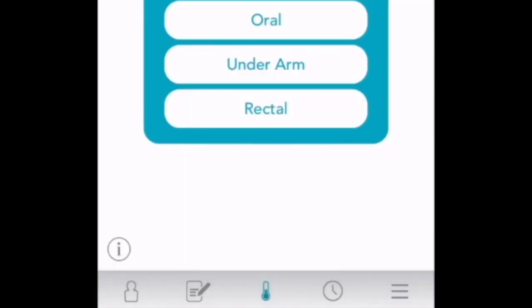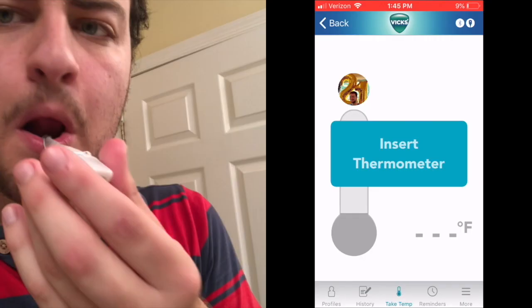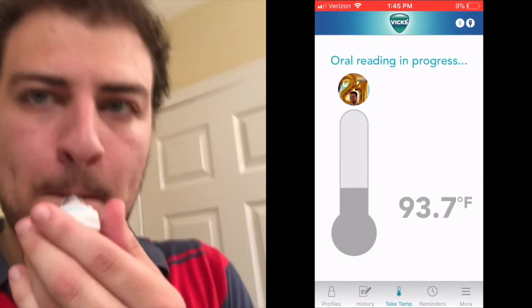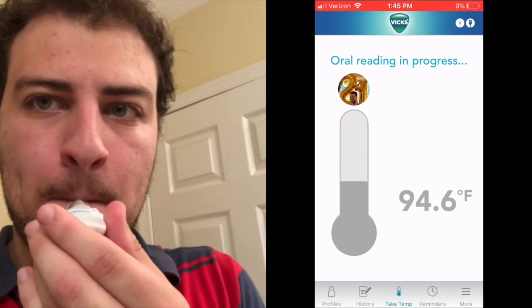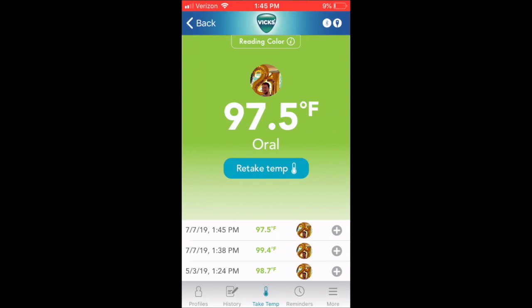We're gonna take the temperature in the mouth. You insert the thermometer — 97.5, that's odd. It was just a few minutes ago showing 99.4, and now it's 97.5. We'll take it one more time because if you have two readings in a wide range, you always want to take it one more time.